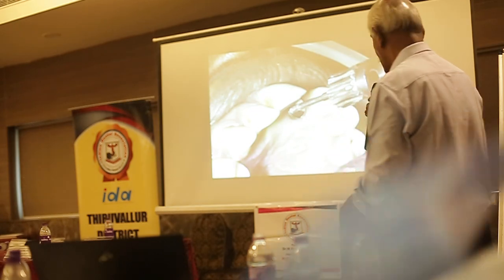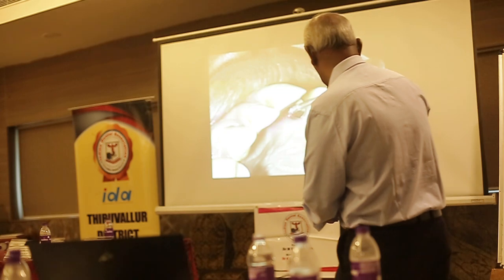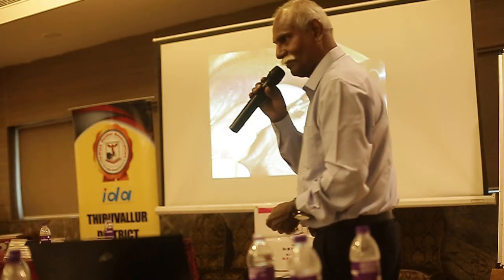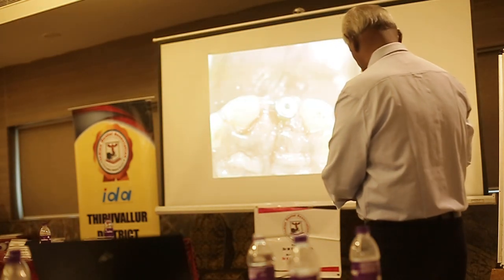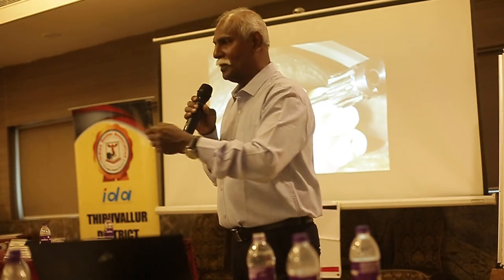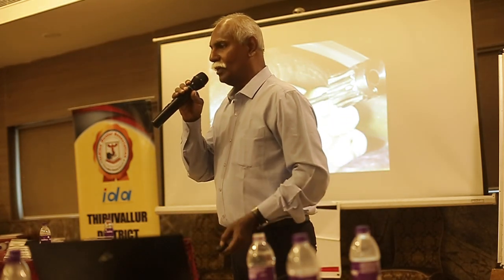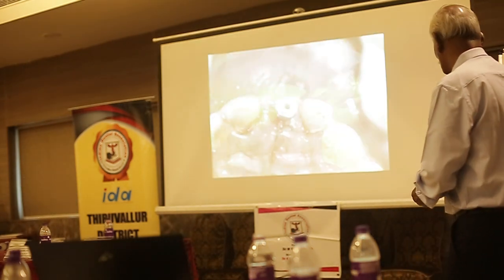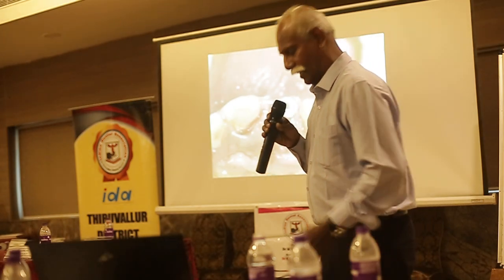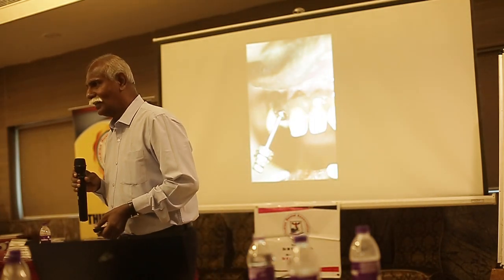Now, how to decide on an angulated abutment? I told you earlier, you draw an imaginary line between the cingulum of the adjacent teeth. Now here, the hex driver falls parallel to the intercingular line. So what abutment can I use? That's right. Beautiful. This case, excellent. So for this you don't need a guide.